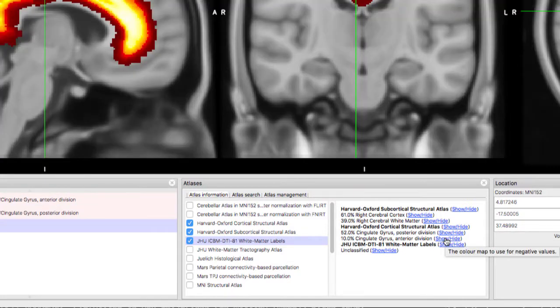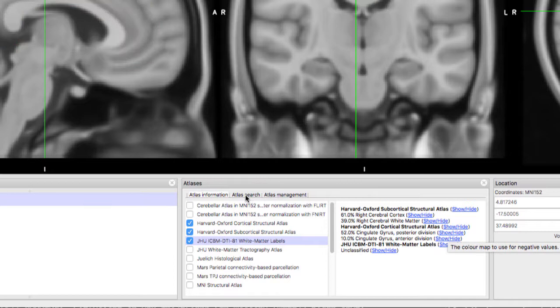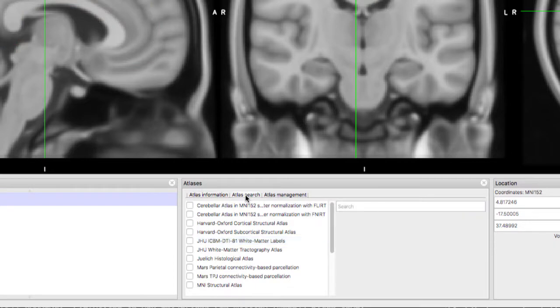If you select Atlas Search, you can display atlas structures. If you highlight the atlas, you can select individual structures.